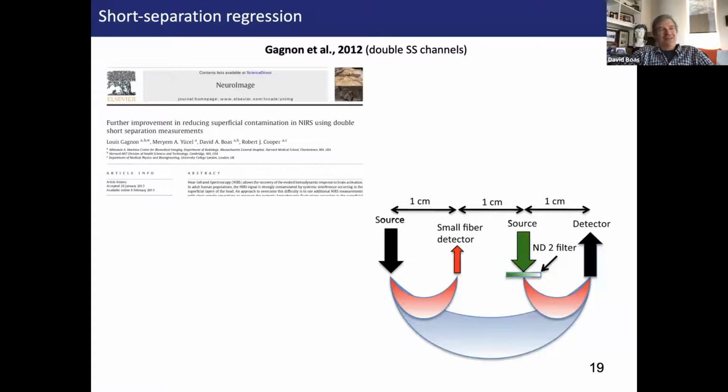Yeah. So Sarah, in that case, we're using 32 sources and 32 detectors, something like that. Right, that's what we are using too. If it was a smaller area coverage, I would be nervous. But it's only working because we're now getting bigger systems that cover larger areas of the brain, so that when you're averaging these medium separation channels, you can be confident that it's not mixing in too much brain, and that it's helping to average out the localized brain activity.